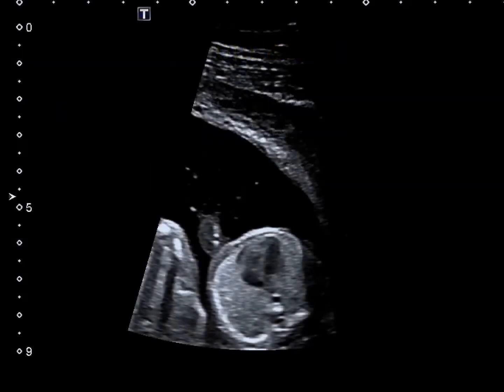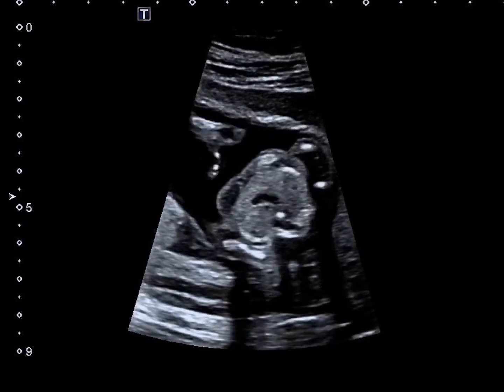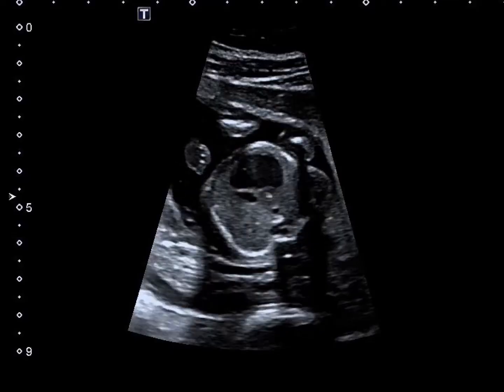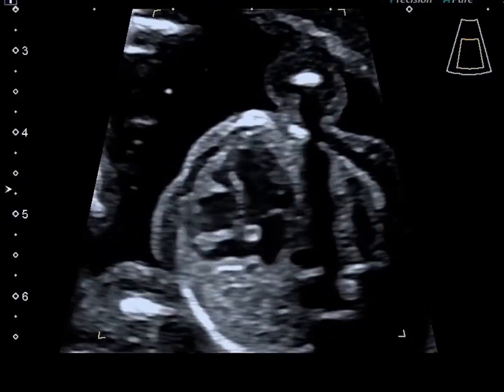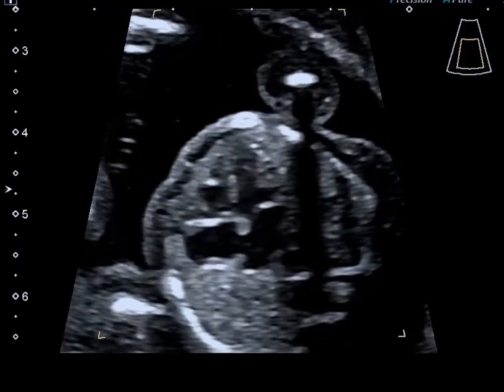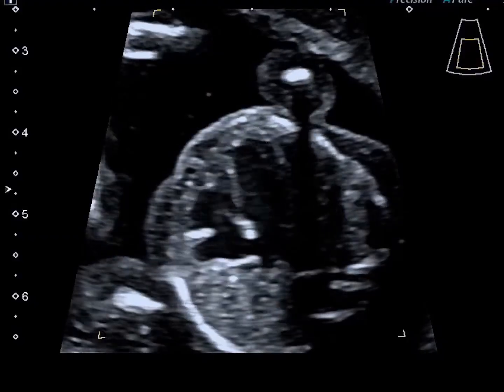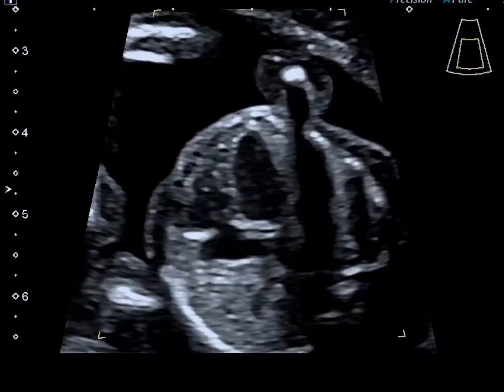And also you want to use a little bit of pressure. This is an example of putting pressure to get the heart closer to the transducer and to put the heart into the focal zone. This clarifies the image, allows for a higher temporal and spatial resolution to make the image really clear so that you can identify any congenital heart disease.